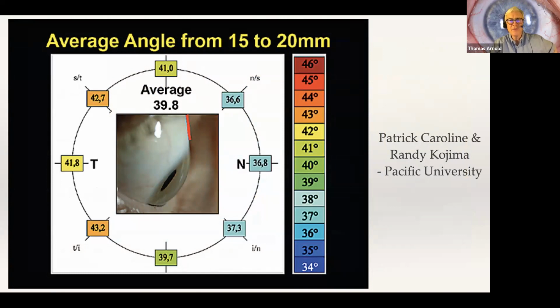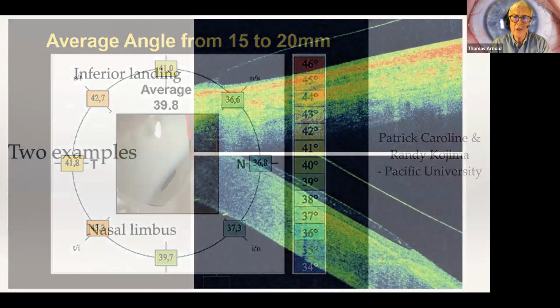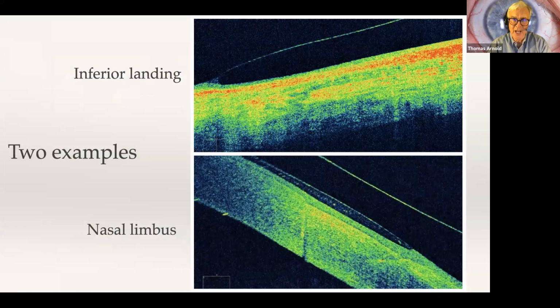So the thing is, these are the angles that change in relationship to the extraocular muscles and distance from the limbus. The other thing that's important to note is this is straight. These angles are very, very straight. They're linear. We're used to fitting curves. We think of the cornea being a curve, and globus and the cone. But when you get past the limbus onto the sclera, it's straight. And so that's what you want to keep in mind when you're designing the haptic.